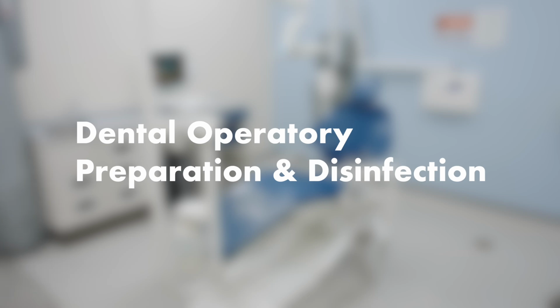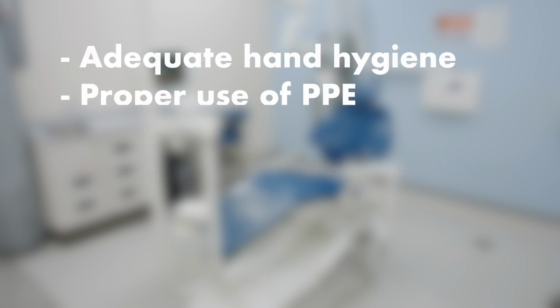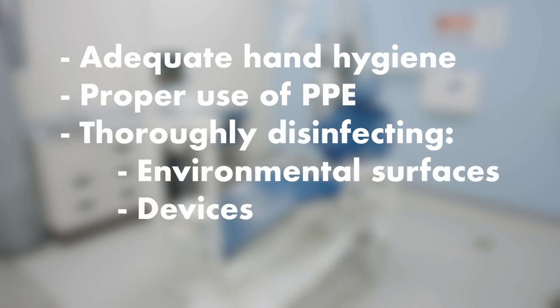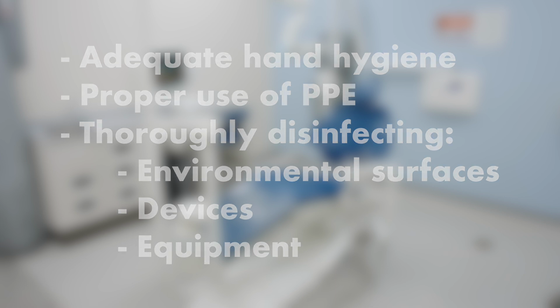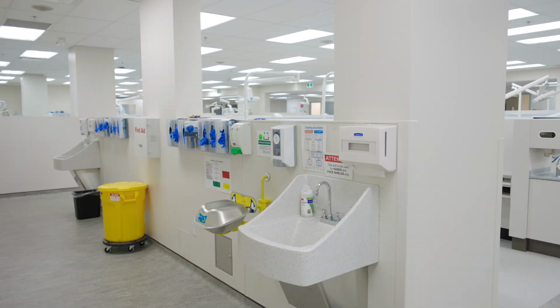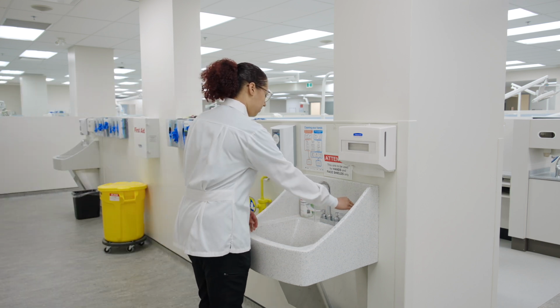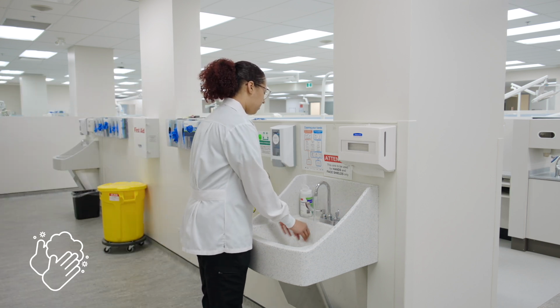In a dental setting, operatory preparation and disinfection are essential to providing safe patient care. Adequate hand hygiene, proper use of PPE, and thoroughly disinfecting environmental surfaces, devices, and equipment are among the most important facets of basic infection control. Upon entering the clinic and before preparing the operatory for patient care, hand hygiene must be performed.